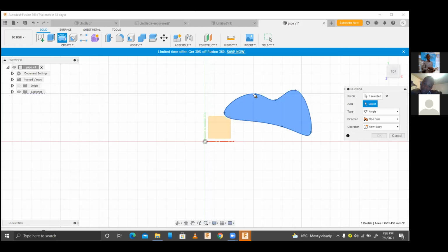Select profile. Up there, select profile. On the revolve, the hanging palette. Select there. Yeah. Then select axis. Now which line do you want to rotate? Is that even a line? It should be a straight line. That's why I wanted you to have the bottom as straight.